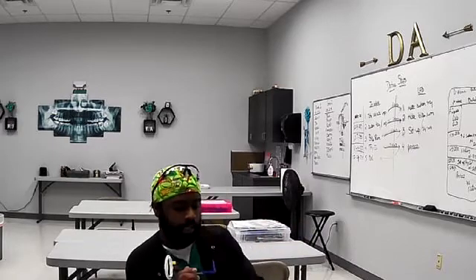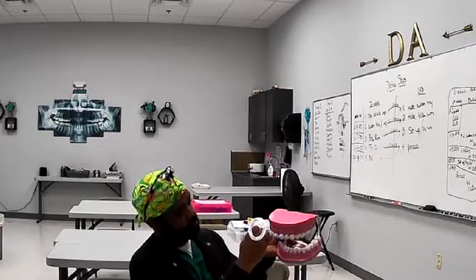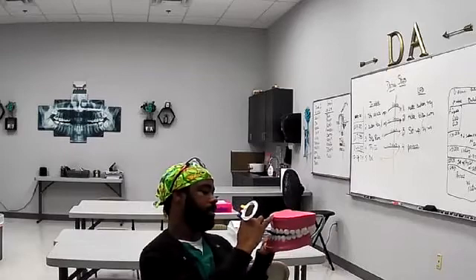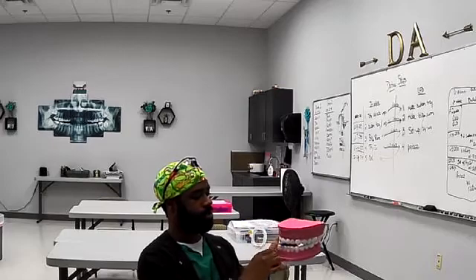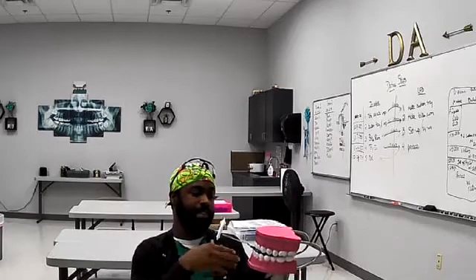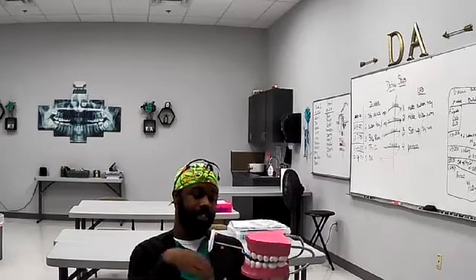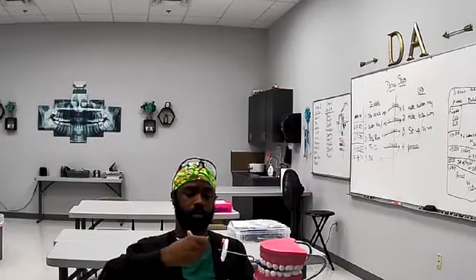So if we say take a PA of tooth number 8, you come to tooth number 8, and then you would shoot it, whatever angle it is. In this case, it's not correct only because this is a model, but this would be your angle. So you would just line your tube head up right here, and shoot it.